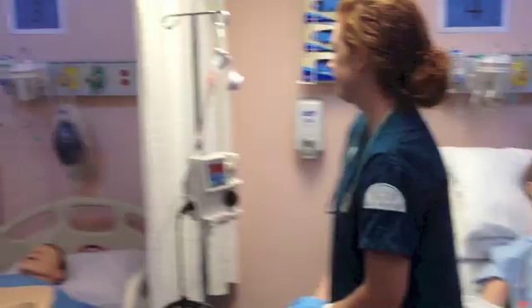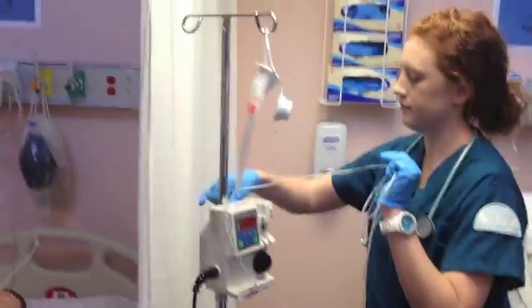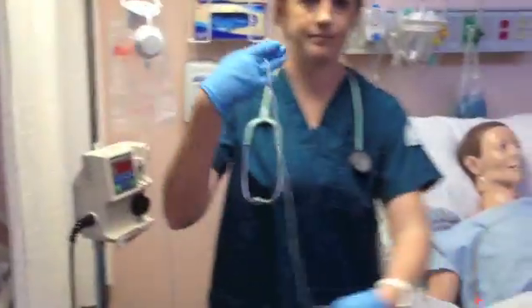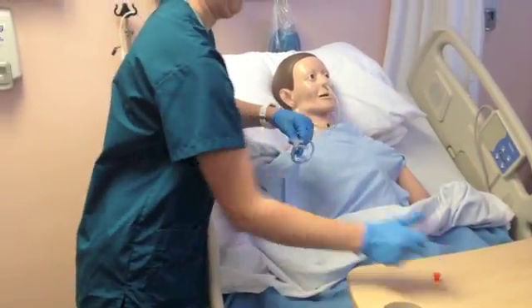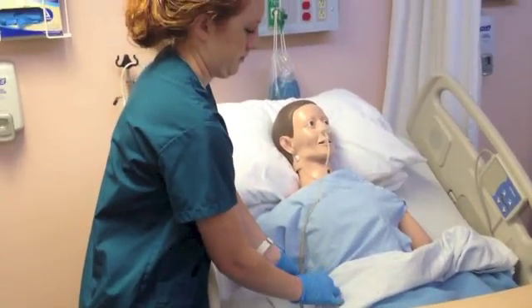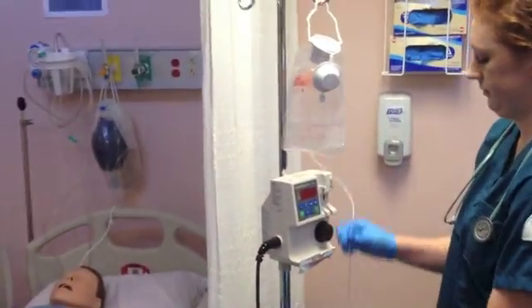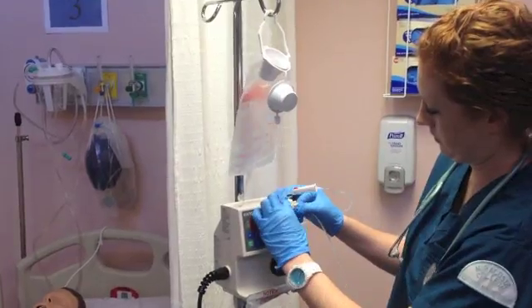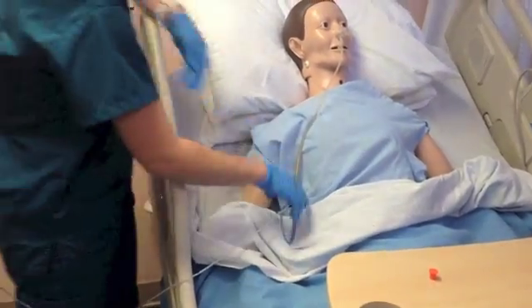Now we're ready to hook up our tubing here. So we're going to take that distal end, hook it up to the NG tube via that Lopez valve, still in the off position. Then we're going to thread the tubing through the pump. Okay, we're going to double check that we're still hooked up to the patient. Probably open up that valve at this point.